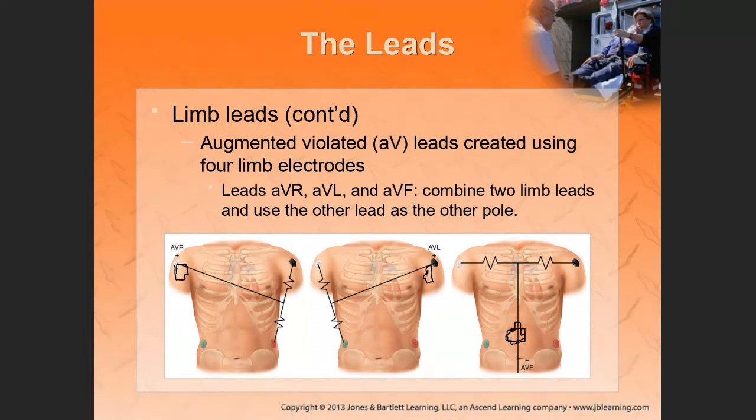Next question, if I am doing cardiac monitoring, how many leads can I look at? That's the next question. I can only look at 3 leads. All right, good. So that's lead 1, 2, and 3. Which side of the heart does lead 1 look at?